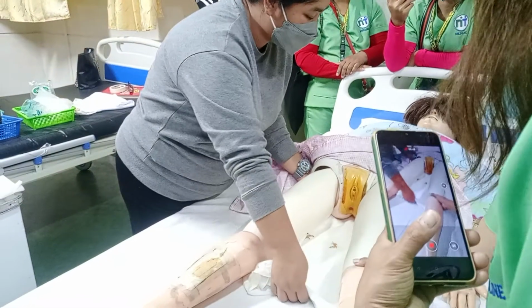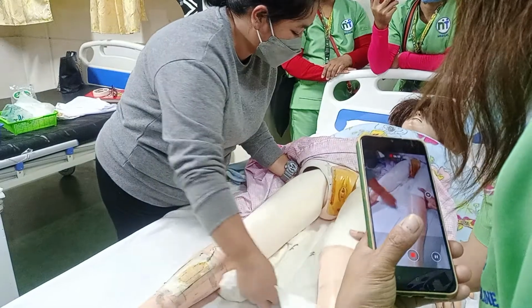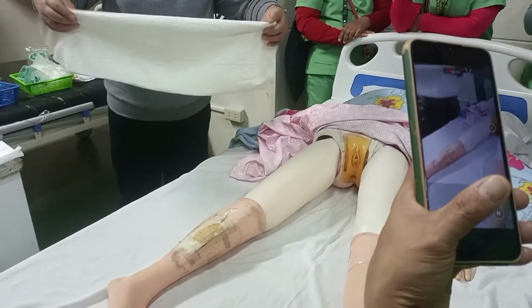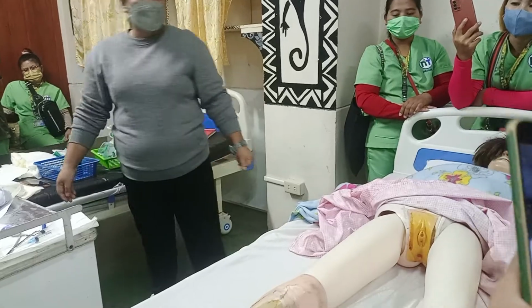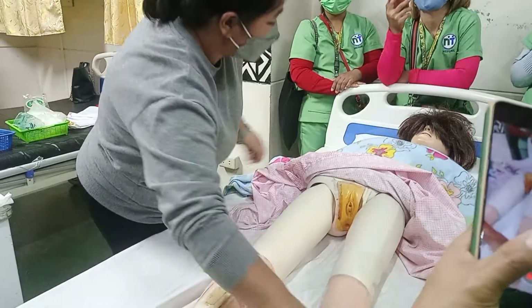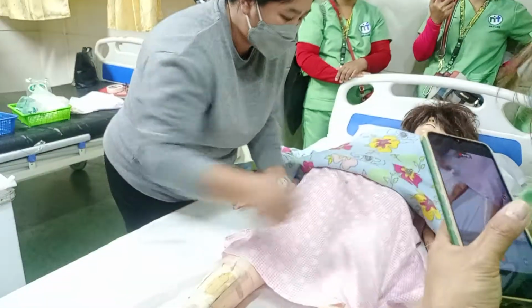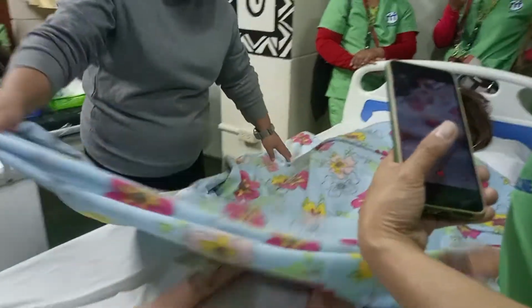At the count of 3, we will raise your buttocks. So, we will remove your underpad. 1, 2, 3. Yung iba, yung underpad din yung pinupunas nila, kasi ang underpad, one-time use naman. Pagbukas mo, tinatapon mo din siya. So, hindi siya nauulit sa ibang pasyente. So, yun na yun yung pinagpapat-dry nila dun sa perineal area. Mas maarte ka, o di tissue, bakit hindi, di ba? Okay. So, there. Thank you, ma'am, for the cooperation.